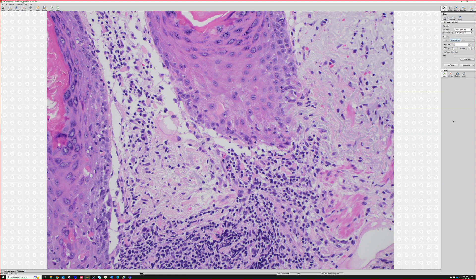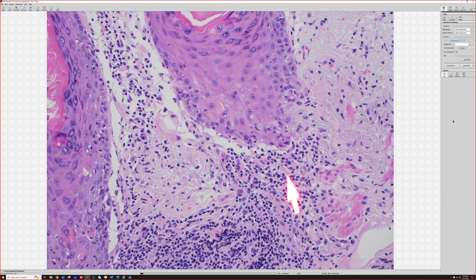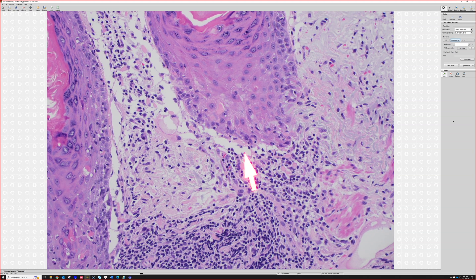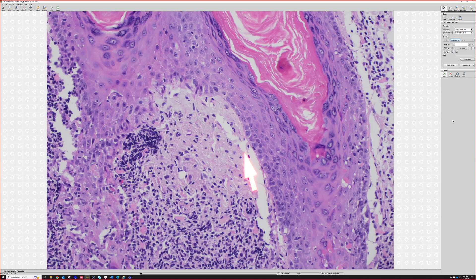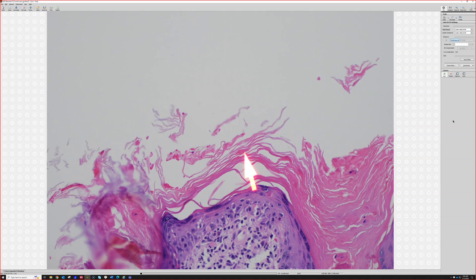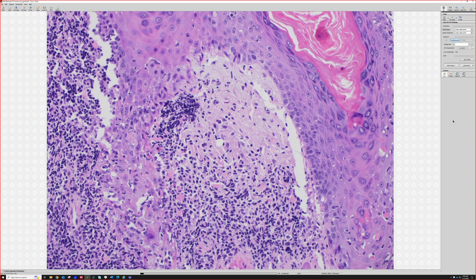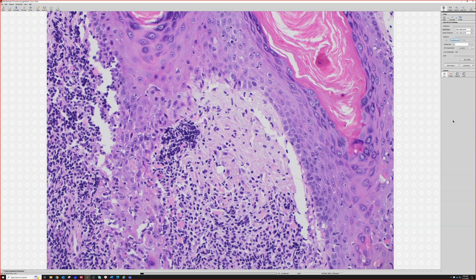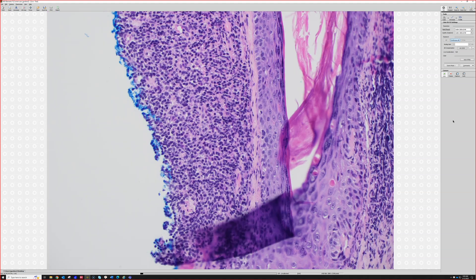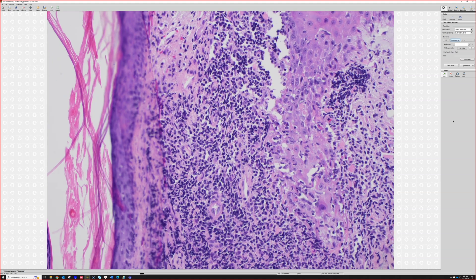Lichen planus doesn't usually involve follicles much, though exceptions exist. Here we have apoptotic keratinocytes or cytoid bodies, vacuolar change, and a ratty, ragged disrupted basal layer — rather than the nice clean basal layer seen in uninvolved areas. This is interface dermatitis involving both the hair follicle epithelium and the overlying epidermis. It may show totally absent burned-out inflammation with thick basement membrane scarring, or it may be thick and lichenoid — it can run a range.